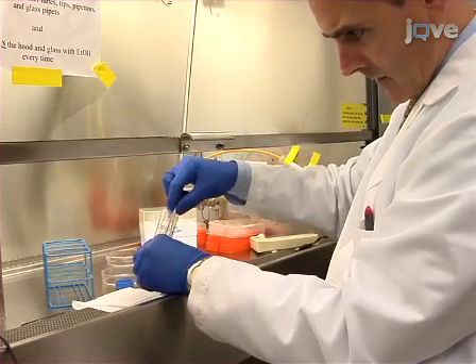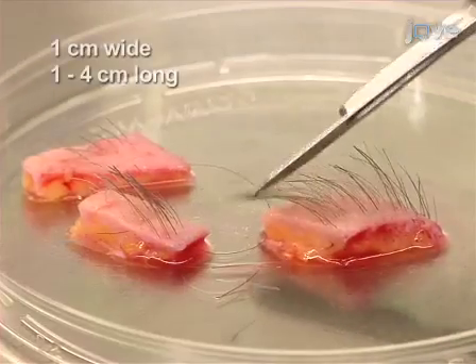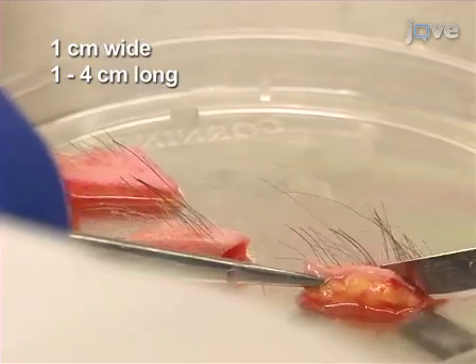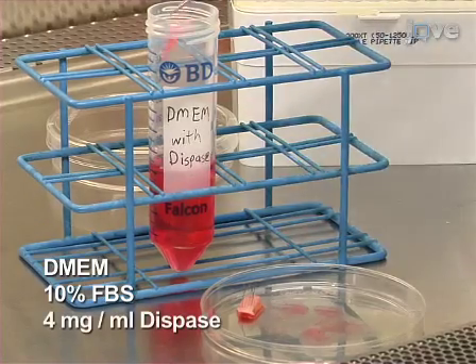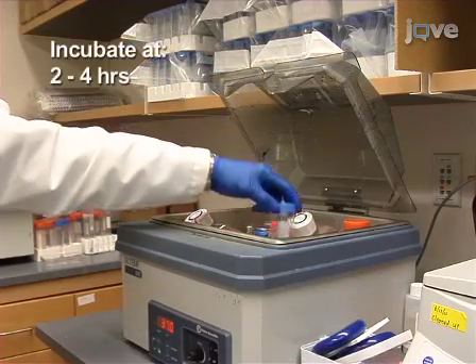To begin extraction of epithelial stem cells from human skin, cut fresh human scalp skin into one centimeter wide strips. Cut parallel to hair growth so as not to cut across follicles. Add the skin to a conical tube with DMEM containing 10% FBS and 4 milligrams per milliliter dispase.